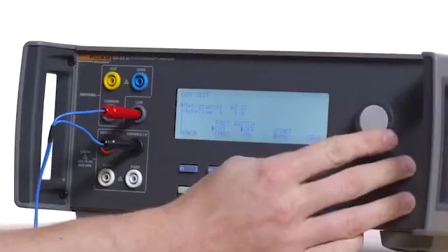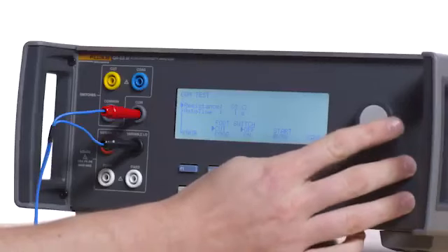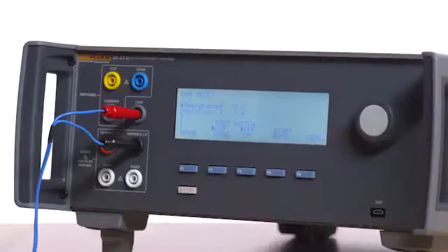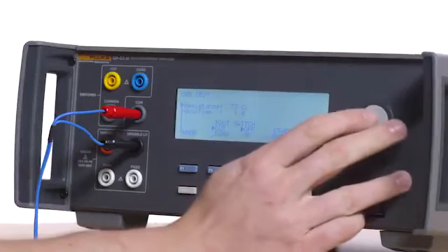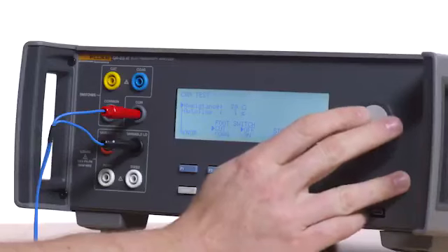Slowly increase the resistance in 1 ohm increments until the REM alarm sounds. The alarm should sound between 77 and 91 ohms.